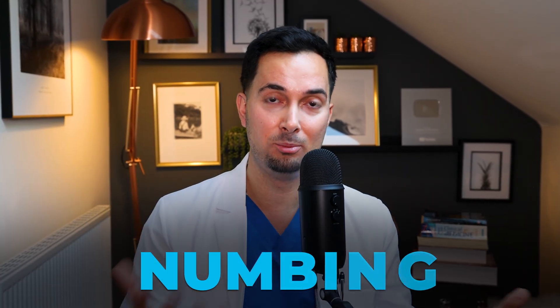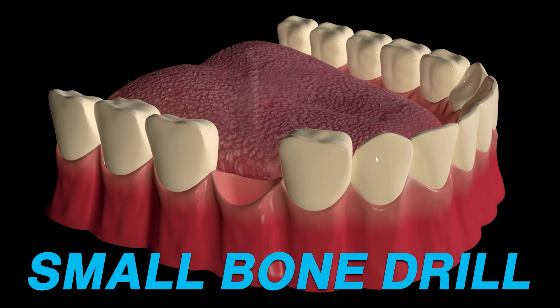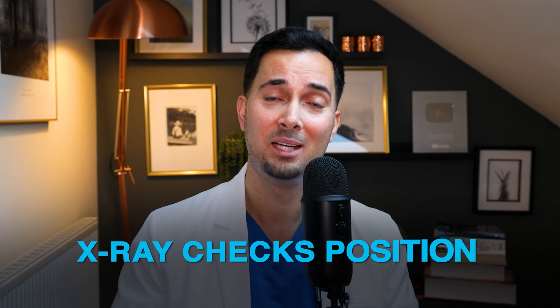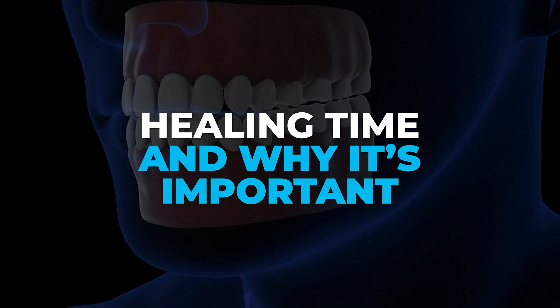First they're going to rinse your mouth with an antibacterial solution, then get you numbed up with local anesthetic just like you're having a filling. The dentist will then drill a small hole in the jawbone and gradually widen it to fit the implant in. The implant is then placed manually or with a surgical tool, and an x-ray checks the position and the gum is closed over or a healing cap is added.